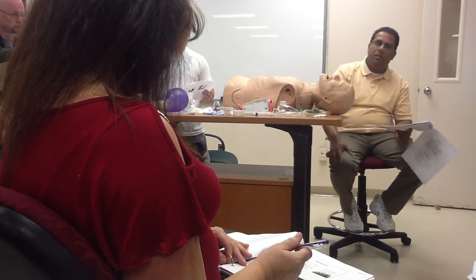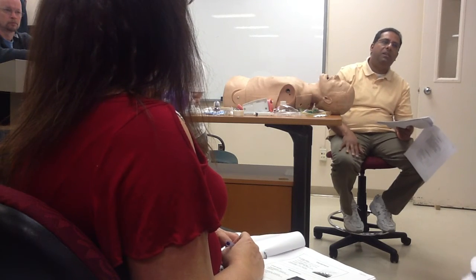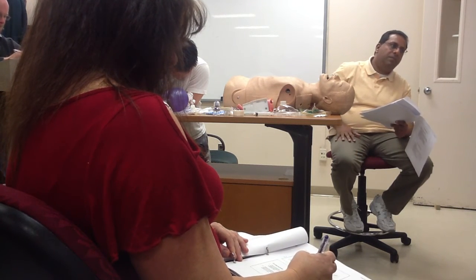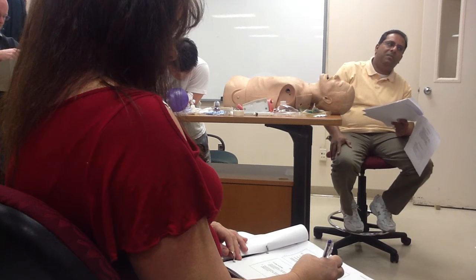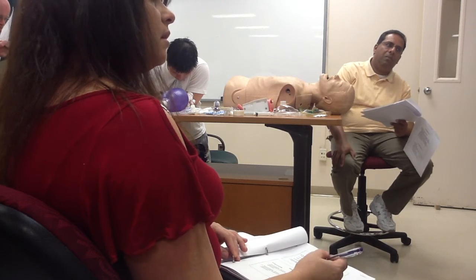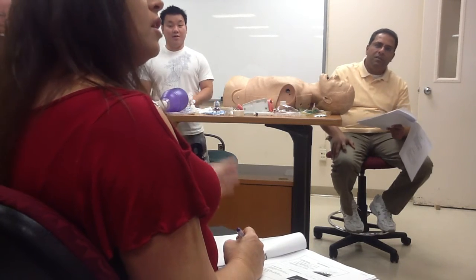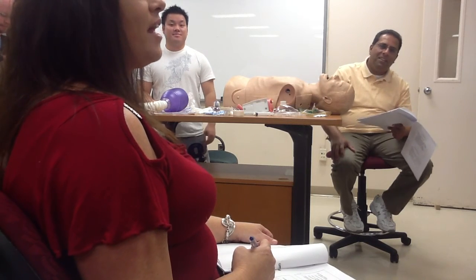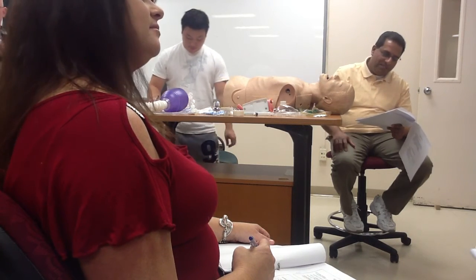That hole above the cup. Everything else has a fancy name. All right, guys, what's the name of the hole? Benny? They have the high-low ET tube. High suction, high suction low. Really? What's the name of the hole at the top of the cuff? Murphy's? No, that's a completely different hole. It's called the suction hole. Are you serious? There's no name for that, it's just called a suction hole. Just call it the Benny hole.